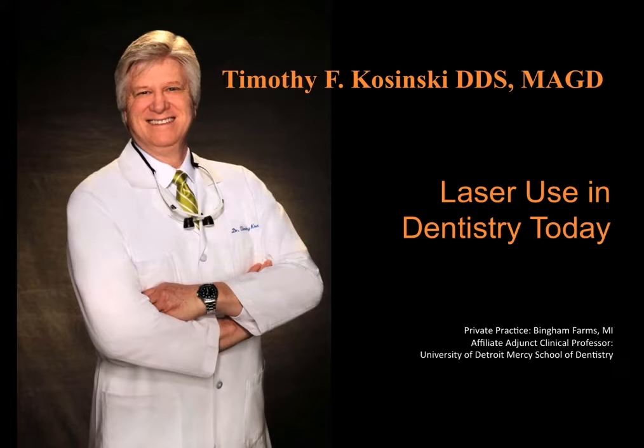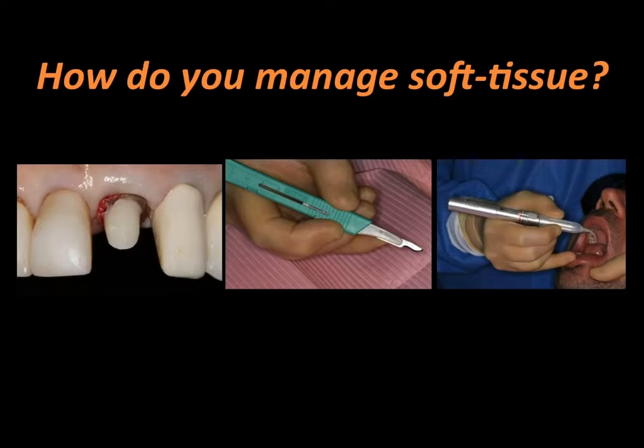So I want to ask you, how are you managing soft tissue in your practice right now? Most of us would probably use a scalpel. We will use retraction cord conventionally, or some of us may still be using an electrosurge, which is a very fast and efficient way of doing it, but a little scary and a little dangerous at this time. So our topic today is learning about the use of the diode laser, and in particular the DenMat diode laser.